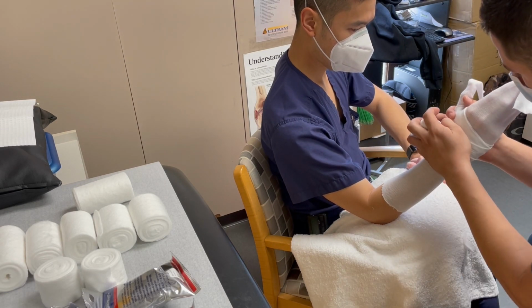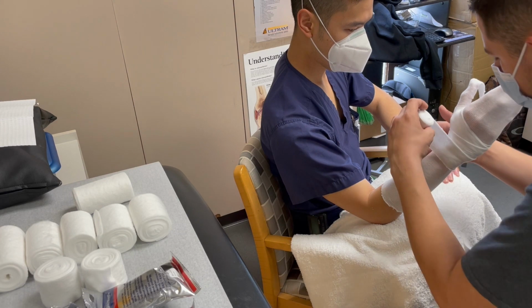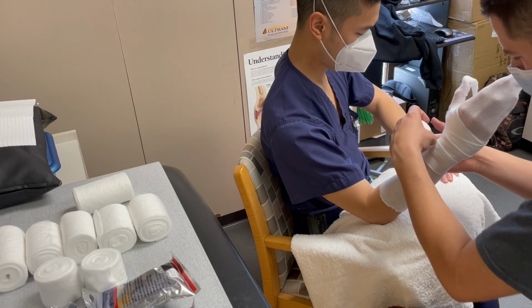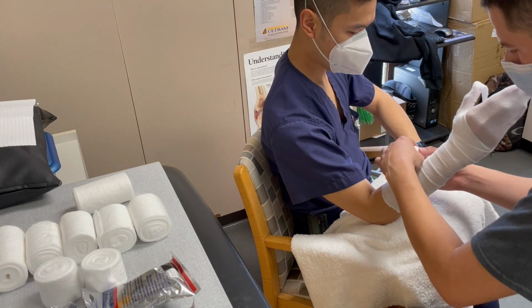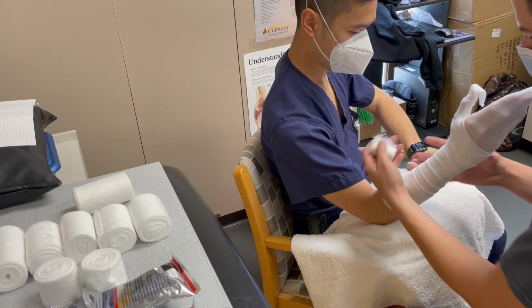As we continue to apply the padding, we must remember to keep the patient in the correct position. As you can notice, we are overlapping one half of the prior layer as we go proximally up the forearm.